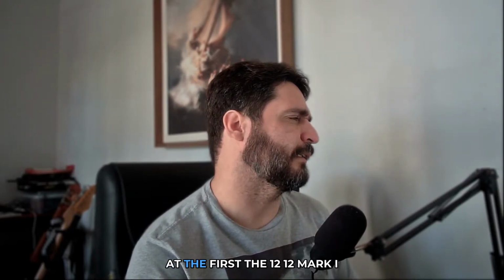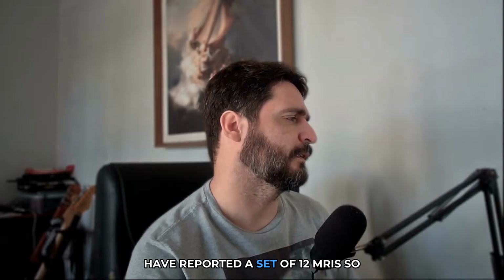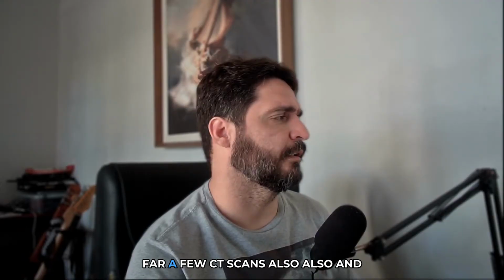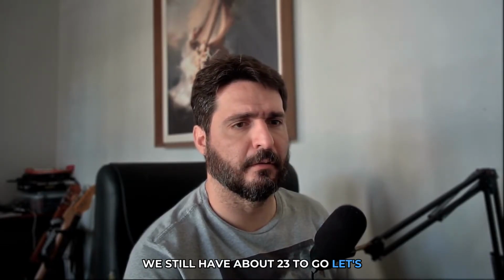Still, I have to report a lot of MRI and CT scans. We are already at the 12 mark. I have reported a set of 12 MRIs so far, a few CT scans also, and we still have about 23 to go.